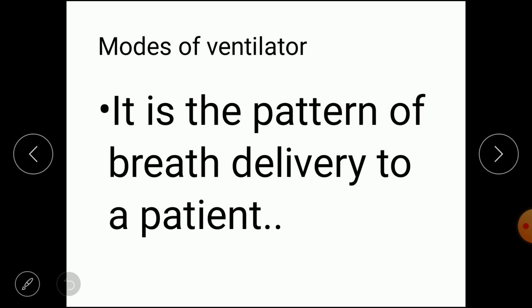Generally, it is the pattern of breath delivery to a patient. Okay, whenever we have to provide a breath to the patient, we will use a mode. So it is a pattern of breath delivery to a patient.